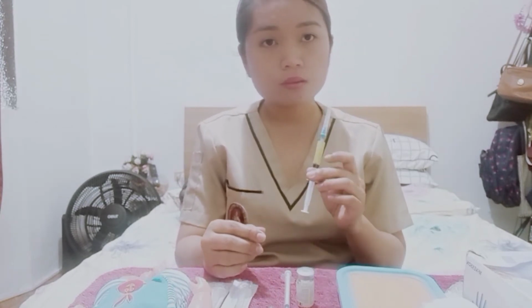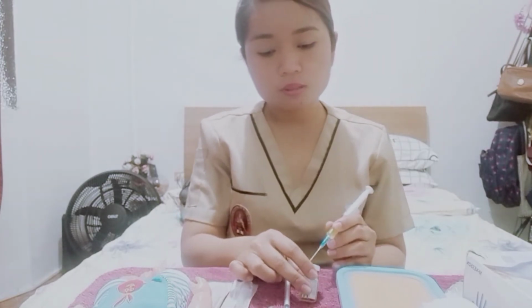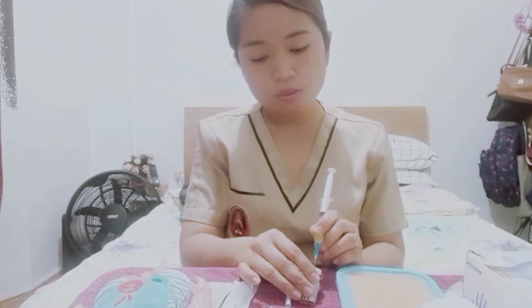So let's see, for example, I've already drawn up the diluent. Okay, so say for example this is going to be the vaccine.